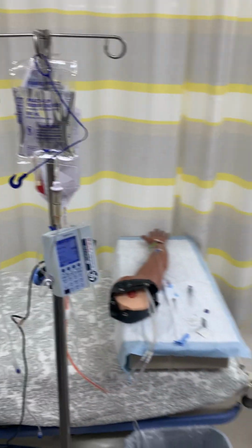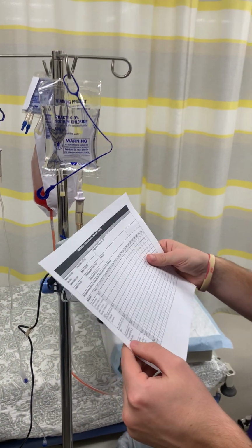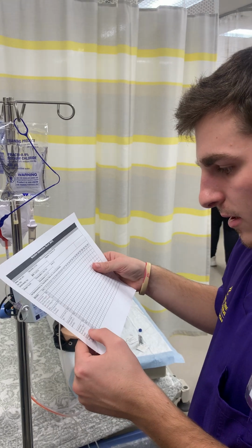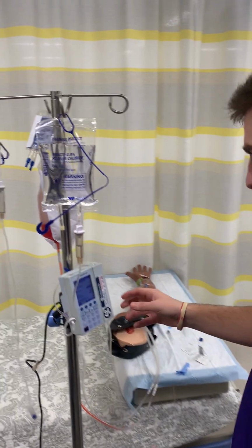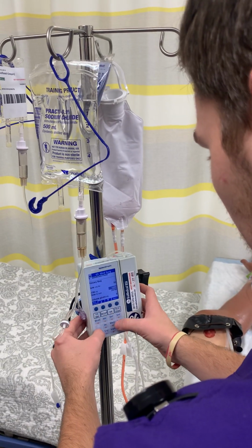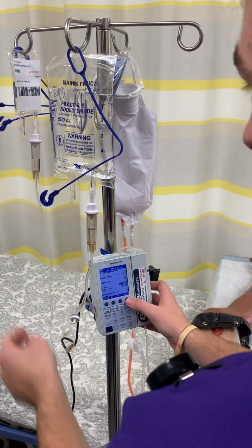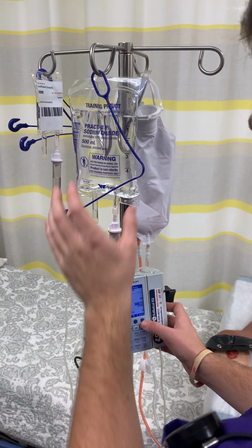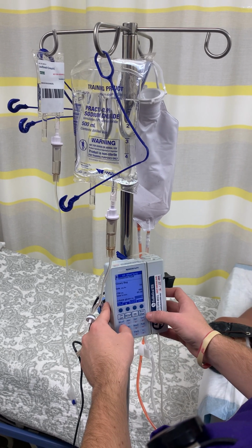And on the MAR here, it says that we are giving it at right here, 50 milliliters per hour. So that's what I'm going to program into the machine here. And I'm going to put it for 480, even though this bag is 500, and this is just to make sure that it doesn't run dry.